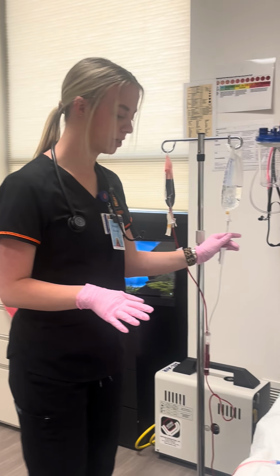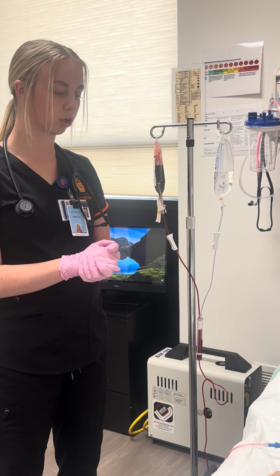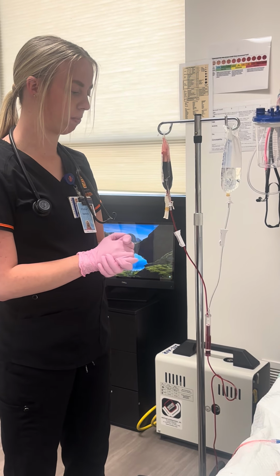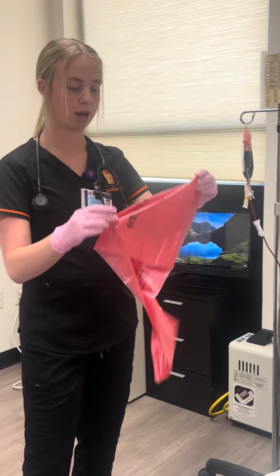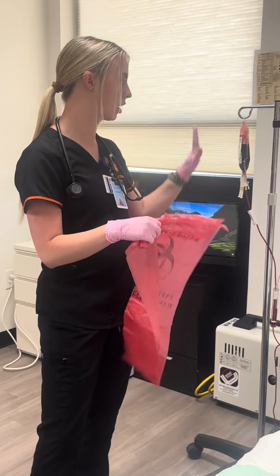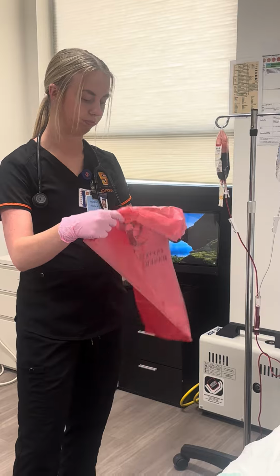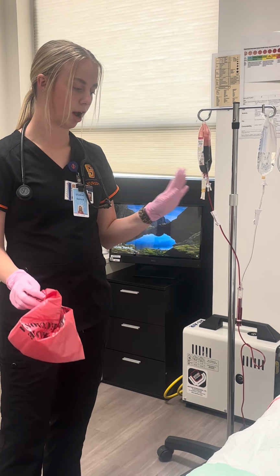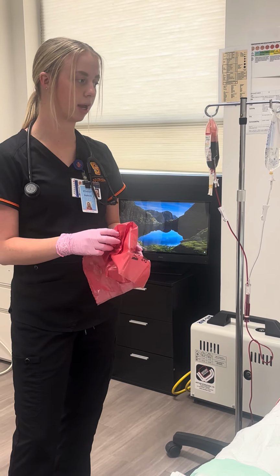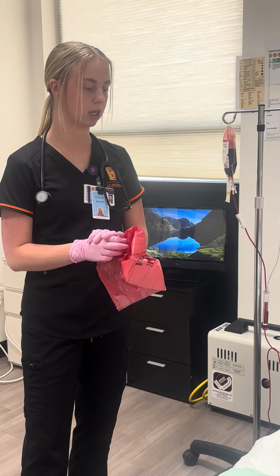After my thing is done, like I said, I would run the normal saline all the way through everything and make sure that it looks good and that I have a clear line before unhooking all my tubing. For the sake of a mess, I am not going to unhook it all, but I would place it all in a biohazard bag, the tubing and the bags, since they would all be used, I apologize, and make sure that everything looks good here. I would flush my lines and make sure that everything is still patent, and like I said, just monitor and check on my patient, and I would document, and we're good.